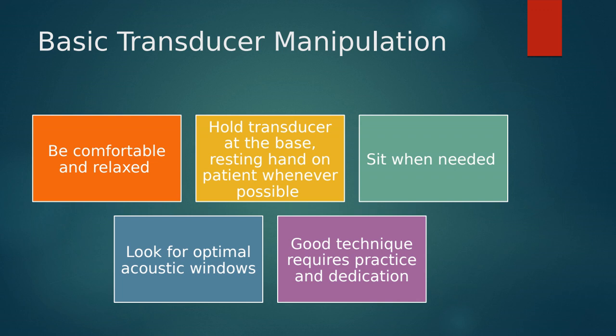So we're going to work on a one-on-one basis and we're going to see what works for each of you individually. We're going to be making sure to look for optimal windows for scanning. So if one approach isn't working, we're going to learn what another approach could look like. Make sure that you are staying dedicated and you're not getting frustrated with the process.